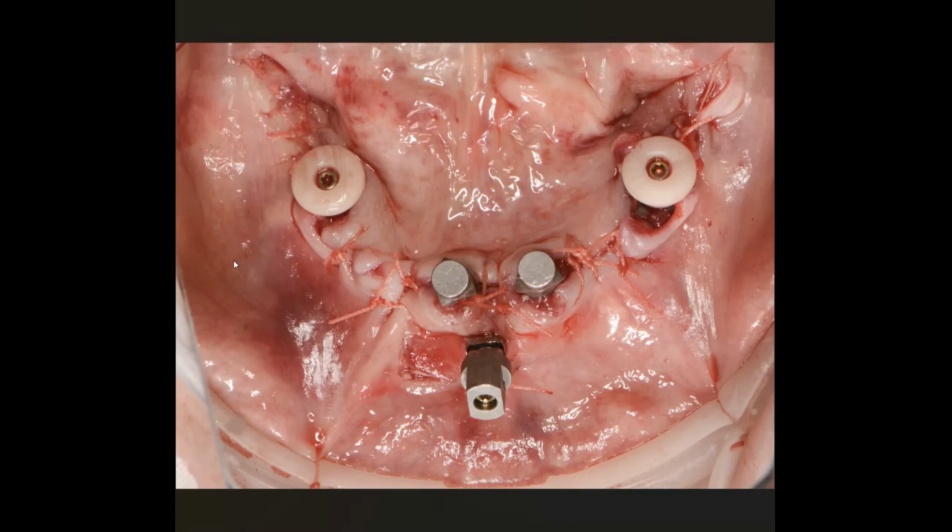You're trying to show the digital technician roughly how thick is the tissue. Okay, why? So that they can approximate how much pressure to put on it. The problem with calling it a tissue scan is a lot of lab technicians who are doing their best, but they're not doctors and they don't really understand the full gamut of ramifications of that term.